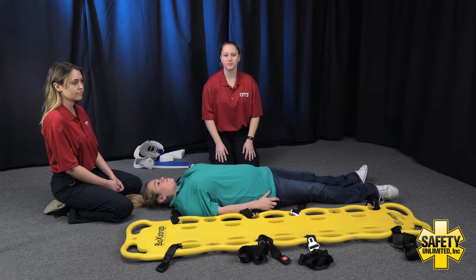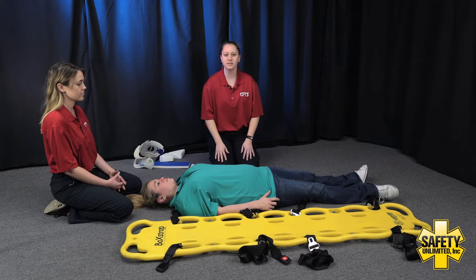Do you have any questions? No. You may begin. Putting on my proper PPE. Is my scene safe? Your scene is safe.